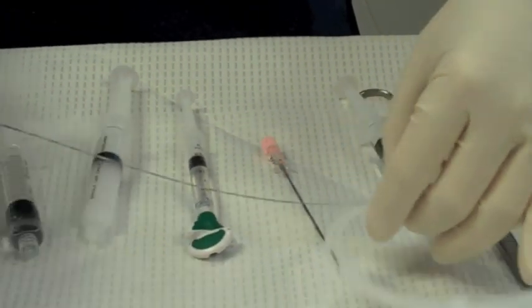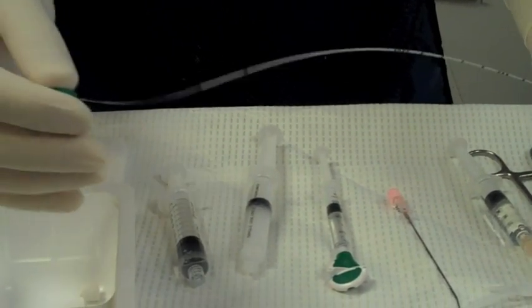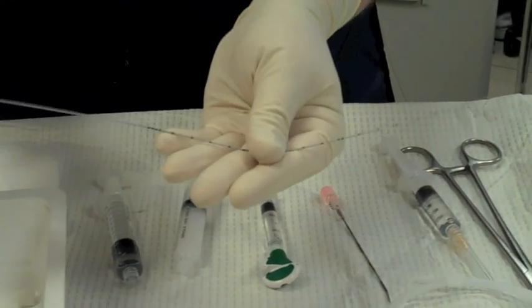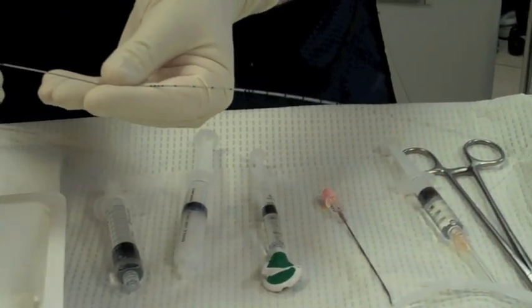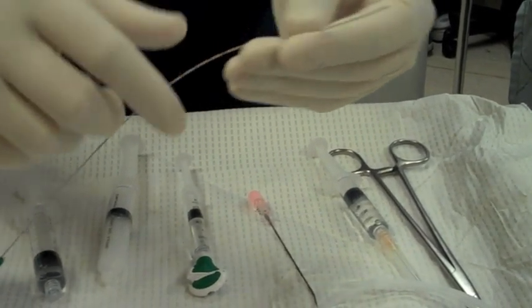The other thing we use that's special for this procedure is a catheter. It has a small wire that slides in and out of the catheter. You can steer this catheter from one side to the other. The other thing unique about the catheter is it has a springy tip, so it will bounce off structures.